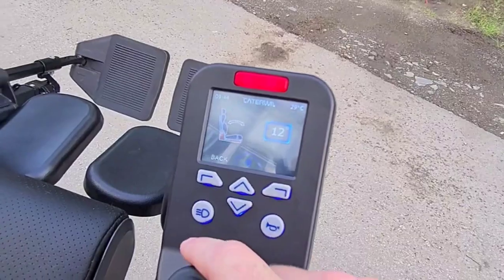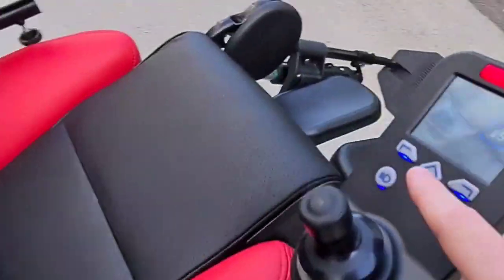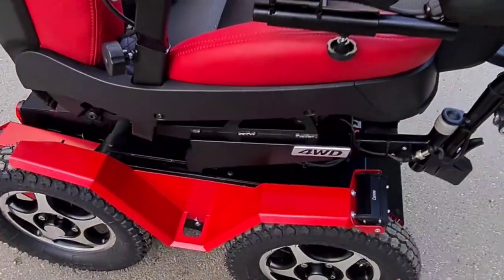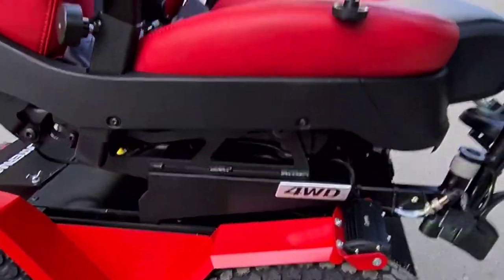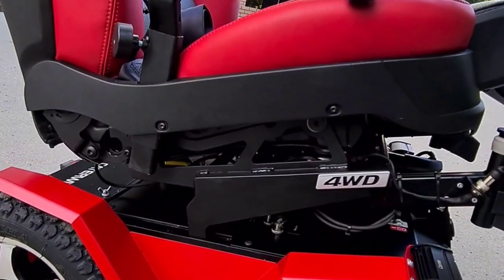Also you can adjust the angle of the seat — only using buttons. So the whole seat can be adjusted.